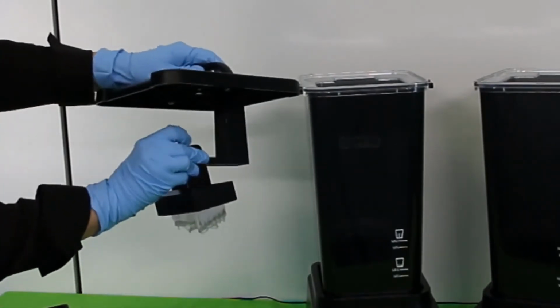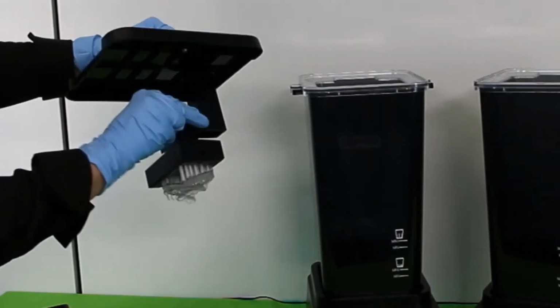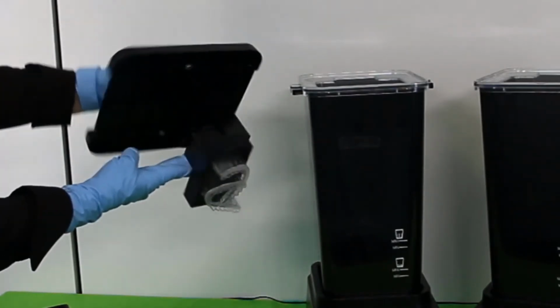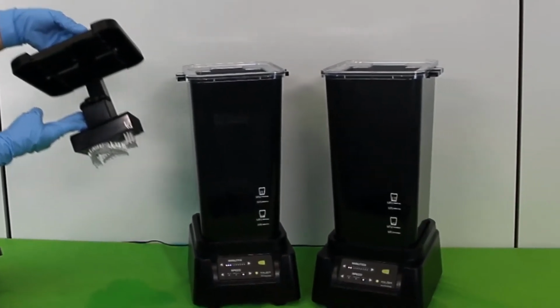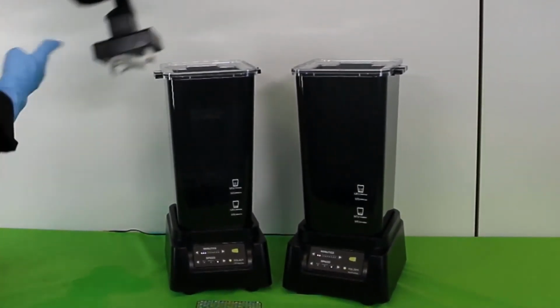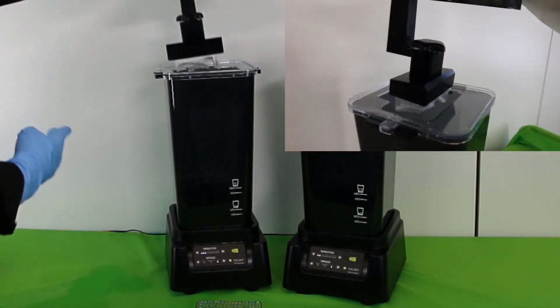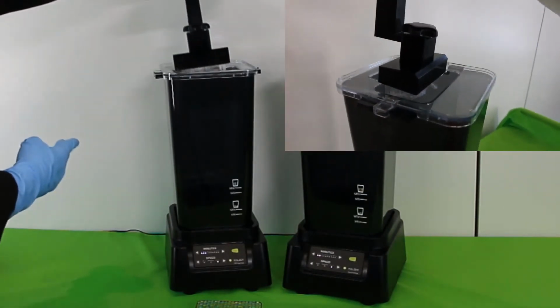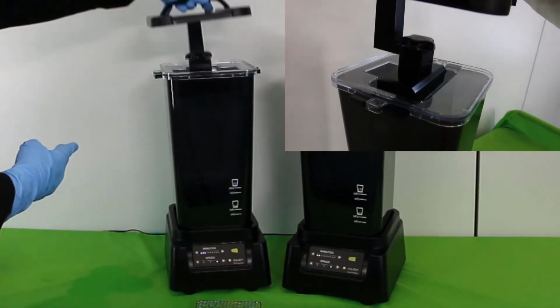After printing, attach the printing platform with the printed object to the build table hanger in the lid. Insert the lid with the not yet cleaned printed object into the device. Pay attention to the correct rotation of the lid. The handle runs parallel to the front edge of the device. Thus, the build table hanger automatically engages in the rear recess in the inner container.